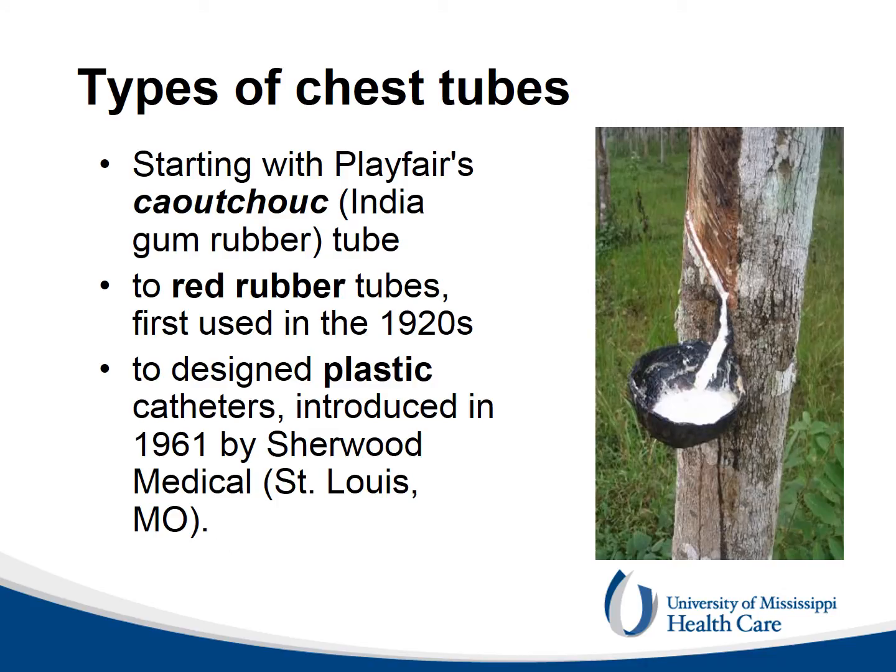The ideal chest tube needs to be soft and needs to retain its original shape at body temperature. It should be resistant to the formation of blood or fibrin clots. The first chest tubes were made out of caoutchouc, later out of red rubber tubes, and finally out of PVC, plastic or silicone.